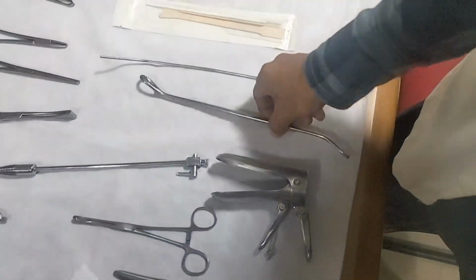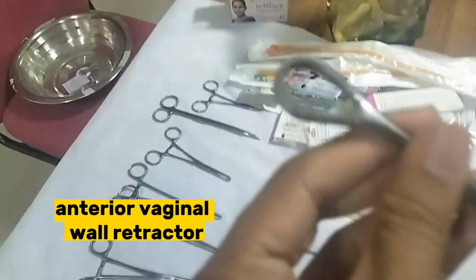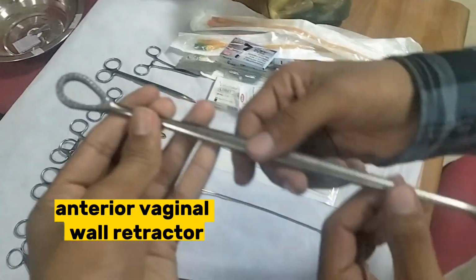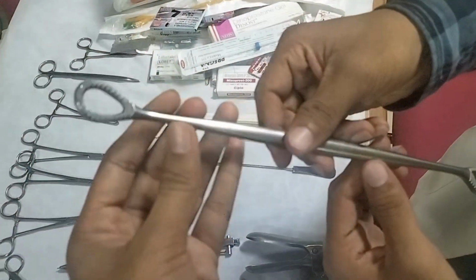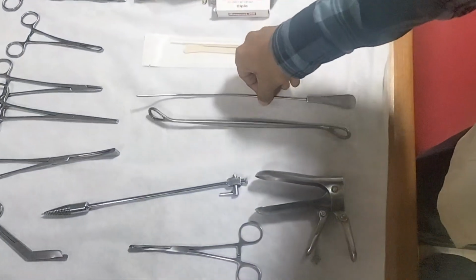Yes. Here is an anterior wall retractor. Anterovaginal wall retractor. Okay, you can see there are multiple transverse serrations, and it is a blunt thing. Don't confuse it with a uterine curette. It is a vaginal wall retractor. It is used to retract the vaginal wall.